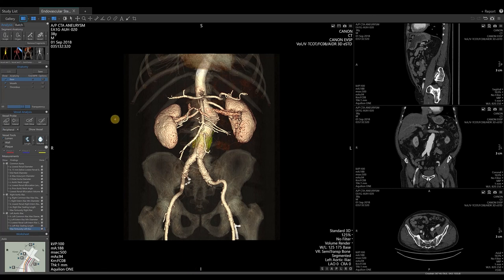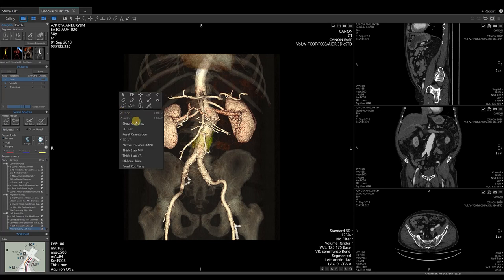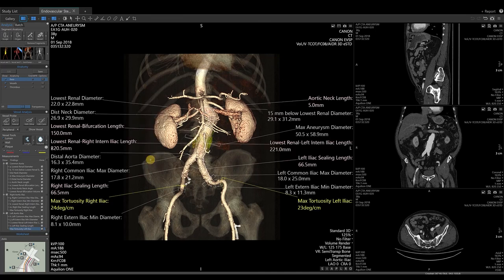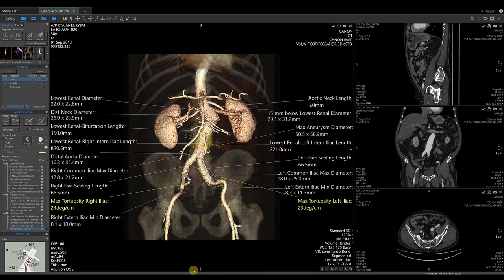To visualize the measurements created in our 3D image, right-click to bring up the right-click menu and select Show Overview. This feature will demonstrate description, value, and location of our measurements on our 3D image. To save this, take a snapshot in the upper right-hand corner of our 3D image. When finished, to close the study, select the X on the Endovascular Stent Planning tab in the upper left corner. This will return you to your study list.